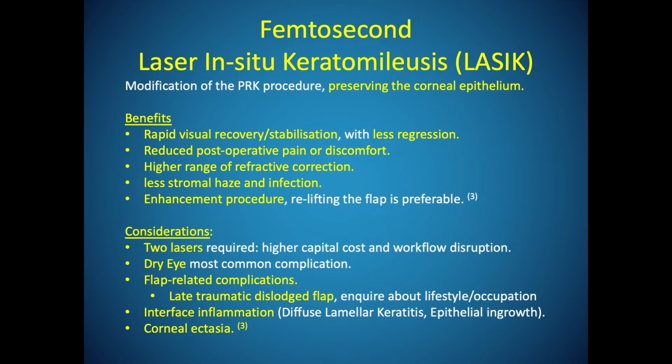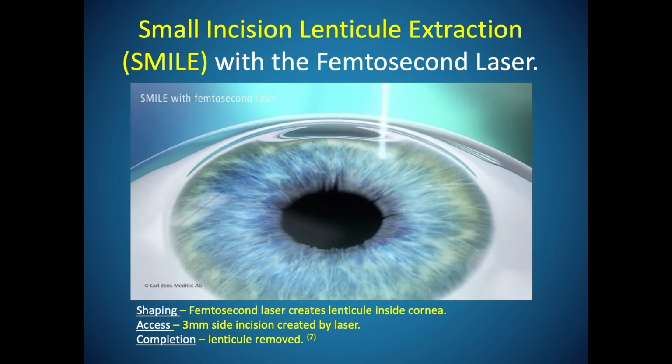LASIK has been the most popular refractive option for the last 2 decades, offering predictable outcomes in experienced hands, enhanced by the introduction of the femtosecond laser for the creation of the flap. Most important benefits include faster visual recovery and less distress for the patient. Important considerations include the high risk of dry eye, flap-related complications, interface reactions, and corneal ectasia.